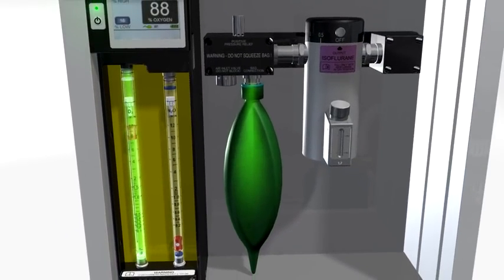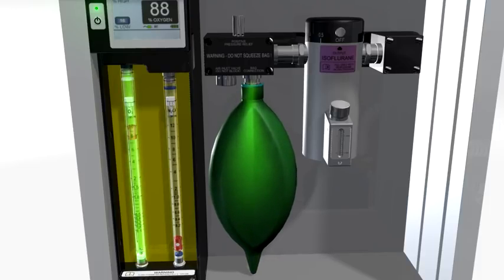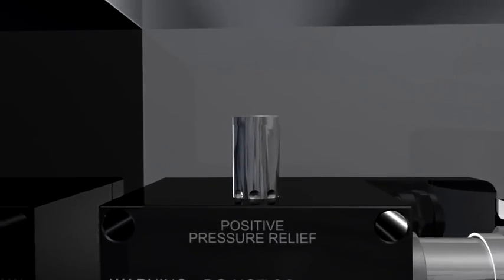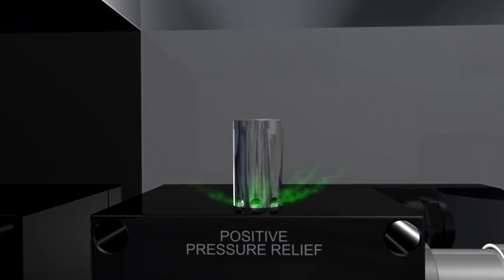The back bar serves three functions. First, the reservoir bag stores the oxygen. It holds up to 2 liters. Second, the pressure relief valve limits pressure in the back bar to 5 centimeters of water, protecting the patient from harm.